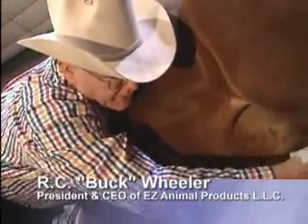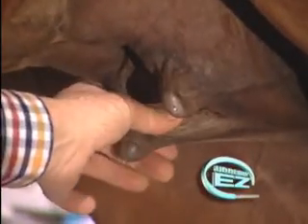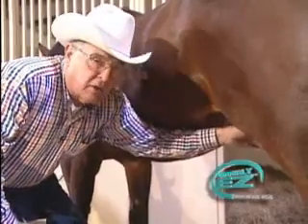We want to make sure that this bag is sufficiently cleaned off. Be sure and wipe down both teats and make sure that the bag is totally clean before that foal has a chance to nurse. The very next thing we need to do is make sure that the wax plugs are out of the bottom of the teats and at least get milk started — get that colostrum flowing before we apply the pump. This is very critical before we start; we want to make sure that it's working.